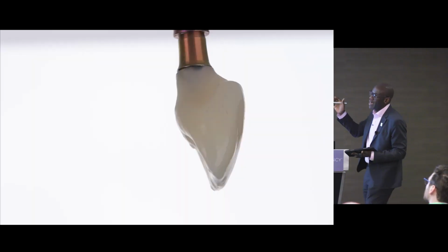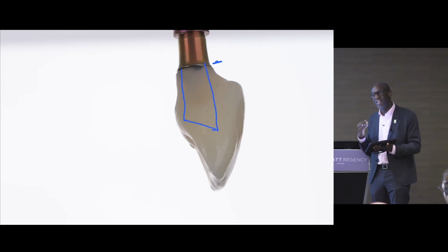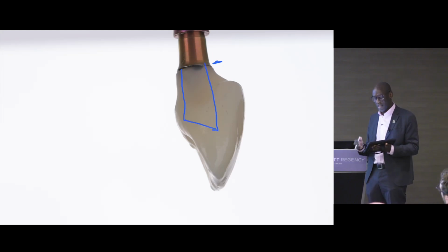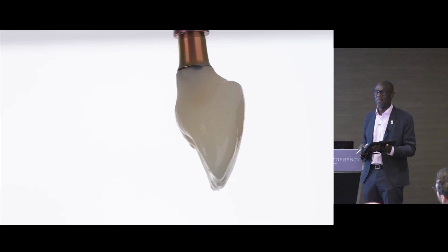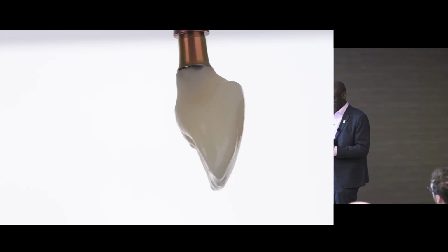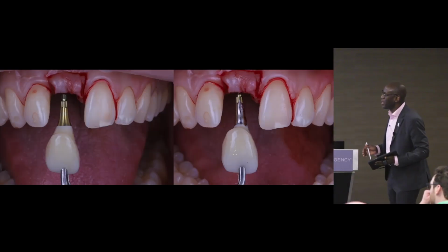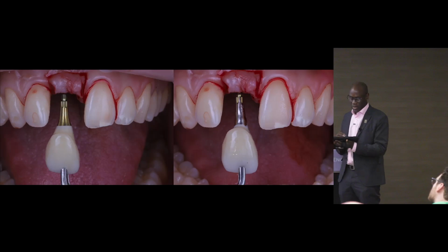It meant that when I remade it, I'm able to use the pictures that you've seen, and by having two things. One is a taller collar height. The second is enough material underneath supporting the resin. It means that, fortunately or unfortunately, he's not come back for the final, but really we're after benefiting patients. So from that perspective, it's been successful, but I would love him to come back so we can do something more for him. And again, the other question I had from someone is saying, look, this is the same, we've seen these before. What I want to show you is another company's tie base.